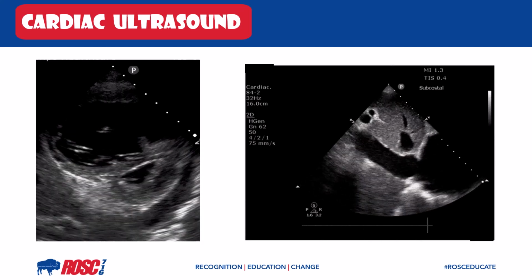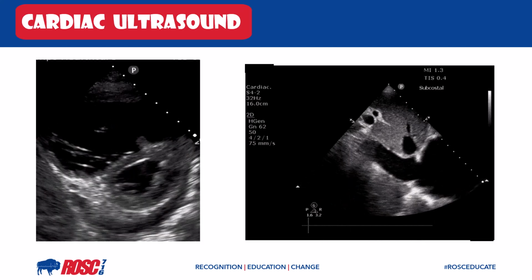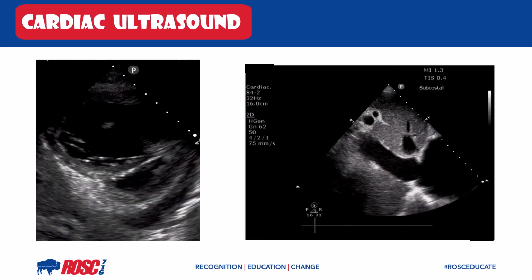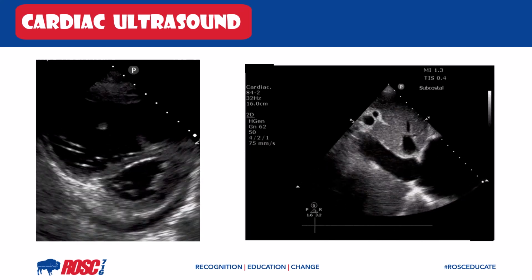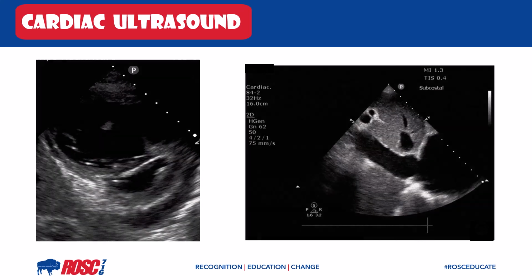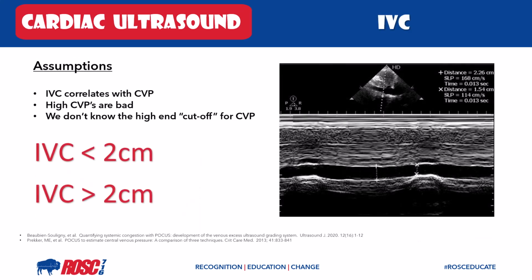I strongly recommend not giving fluid to this patient, but since it's a fluid tolerance lecture, the correct comment from me would be that further investigation is needed prior to making that decision. We'll talk about the additional POCUS investigations very shortly in the upcoming slides. Before that, let's move on to the infamous IVC.